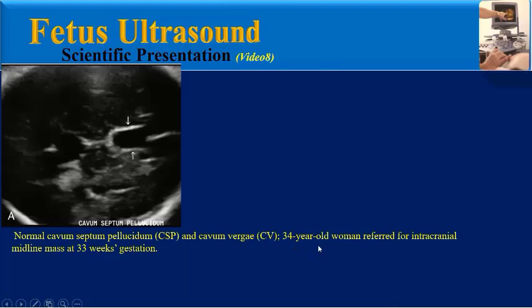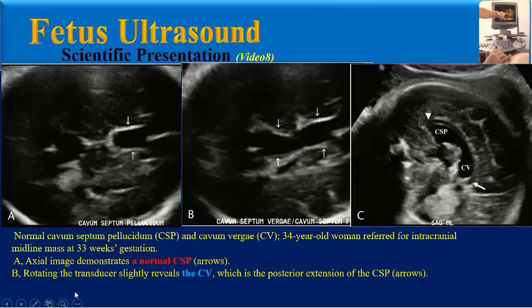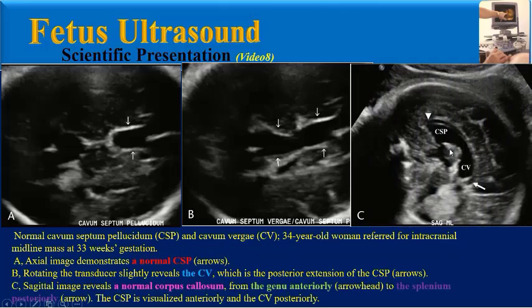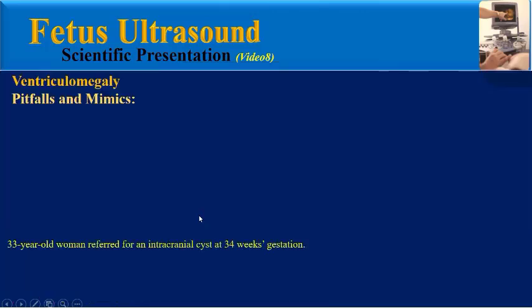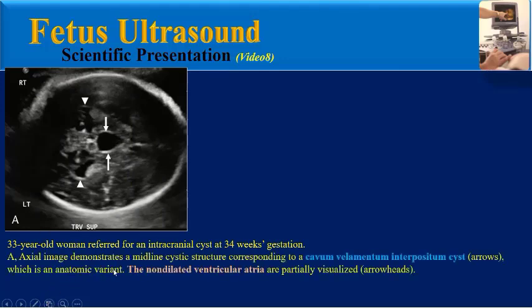Teaching case: A 34-year-old woman referred for intracranial midline mass at 33 weeks gestation. An axial image demonstrates a normal cavum septum pellucidum. Rotating the transducer slightly reveals the cavum vergae, the posterior extension of the CSP. A sagittal image reveals a normal corpus callosum from the genu anteriorly to the splenium posteriorly. Another case: A 33-year-old woman referred for an intracranial cyst at 34 weeks gestation; axial image demonstrates a midline cystic structure corresponding to a cavum vellum interpositum cyst, an anatomic variant.